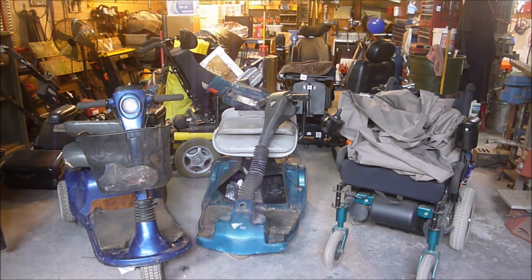But anyway, barbecue covers, I usually throw a tarp on top of the chair after strapping everything down. Throw a tarp on top of the chair, throw the barbecue cover on top of the chair. That pretty well covers the top if it rains or something like that. Now, the barbecue cover works really well for rain, and barbecue cover and tarp. But on the way to the big city, when I go there, if it's really pouring down rain, rain will come up from underneath the lifts that go on the back of your car, and so I put plastic garbage sacks around the motors and tape them on, and really, you know, that kind of stuff.